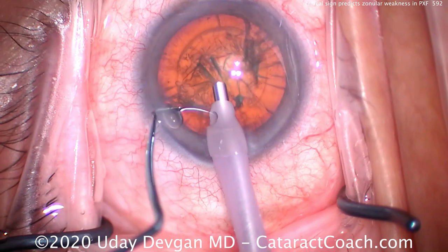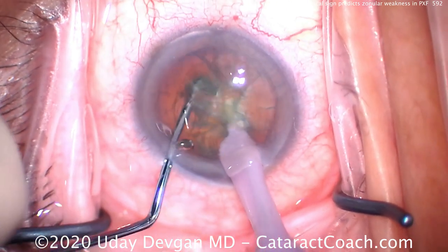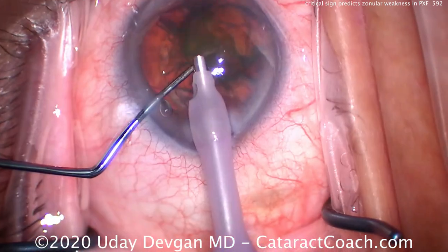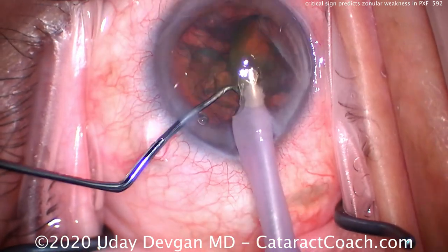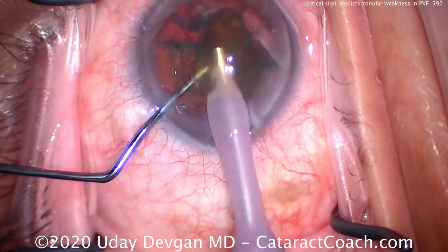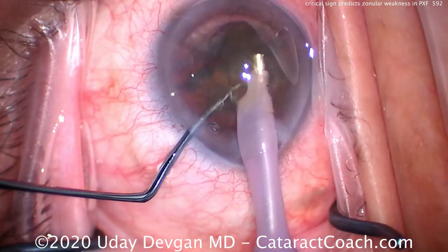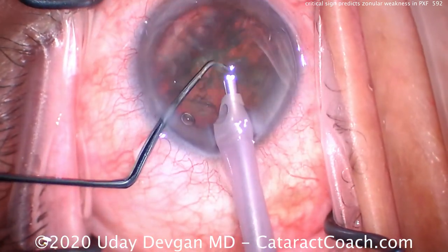Let's do a quick phaco chop here before we get to that, just to show you our technique. Buzzing in the nucleus, digging in the chopper — there are two halves. Now with that five millimeter capsulorhexis we can easily bring a hemi-nucleus up and emulsify it in the iris plane. It's very important to have that five or even five and a half millimeter capsulorhexis to prevent or limit capsular contraction and phimosis.